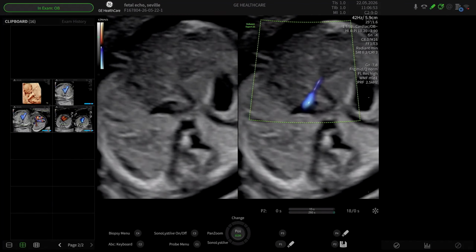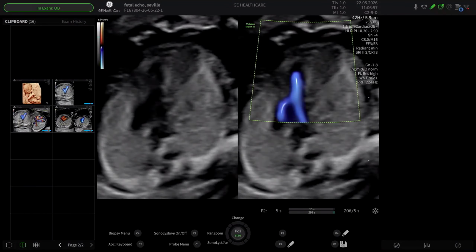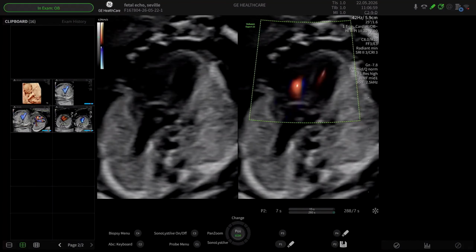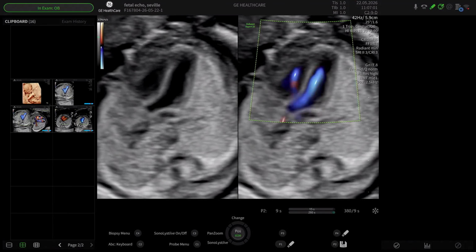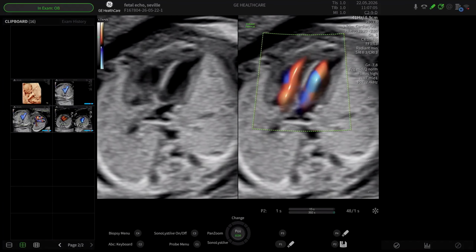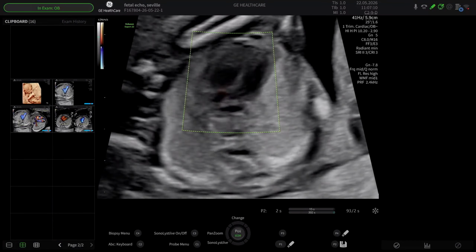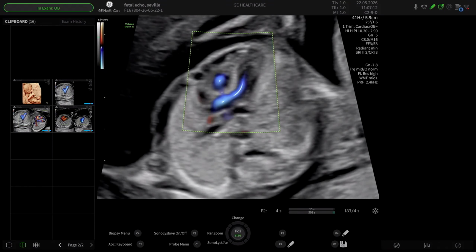And then the last control that I touch is my color control. And then once I increase my color control, then I'll get better fill of the ventricles. I'm going to slightly increase that as well. I'm going to increase the 2D. So as I'm looking at that inflow into the ventricles, I go back to a single screen. I can't see any evidence of tricuspid valve regurgitation.